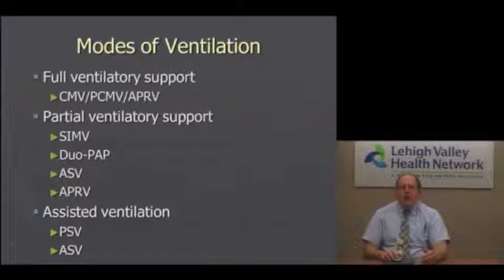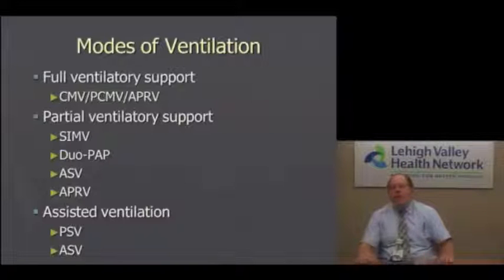So let's talk about the modes of ventilation. We have a lot of different ventilatory modes available because, to be honest with you, there is no perfect ventilatory mode. If there was, there would be only one mode on the ventilator. So what we really look at is a lot of different options. I like to say we have a lot of weapons in our arsenal when it comes to mechanical ventilation, because we have a diverse patient population. As you saw earlier, there are a lot of reasons why patients go on mechanical ventilation, so we have to be able to have a large array of choices for them.